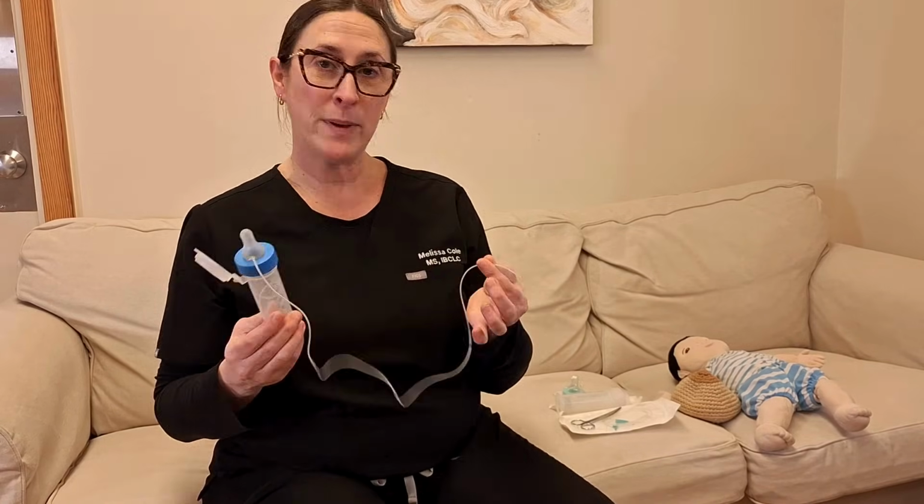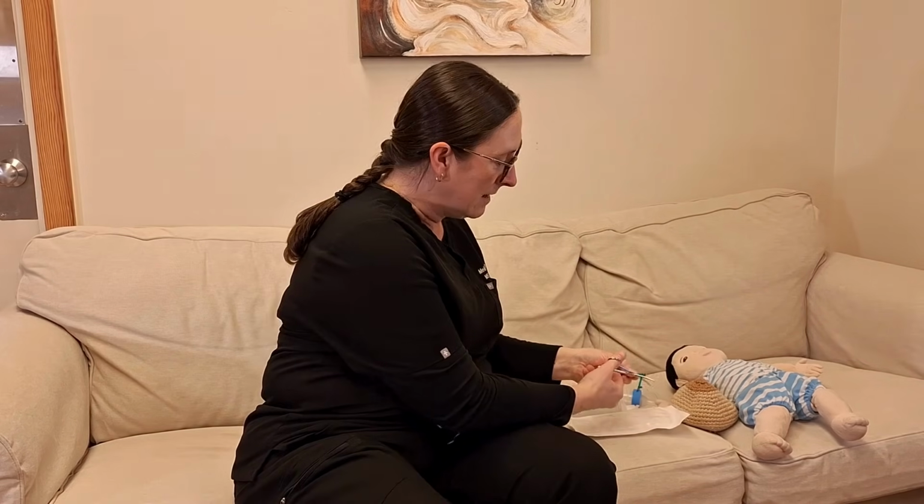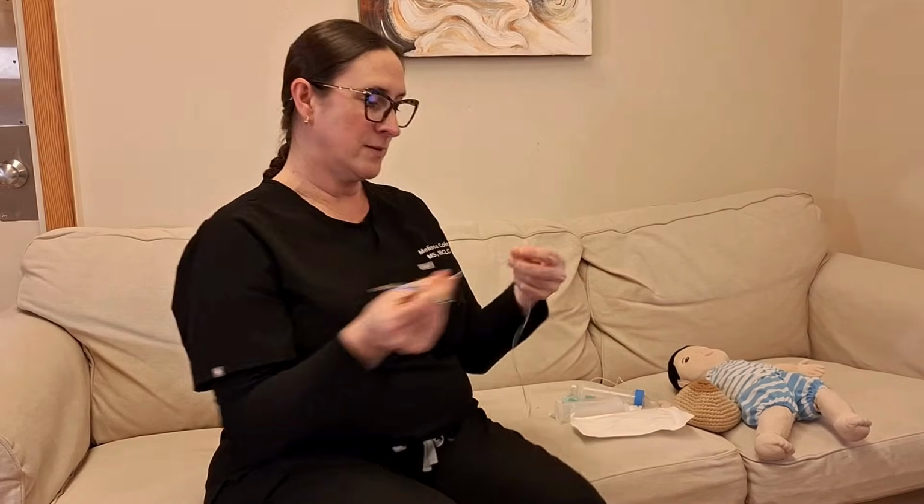So first, in preparing it, there are various tube styles, different plastics, different lengths. So I'm just going to show you how we typically take a 5 French feeding tube. This is classically a 5 French NG tube. I usually take the little port off the bottom since we're not going to need that. All right, so our tube is ready.